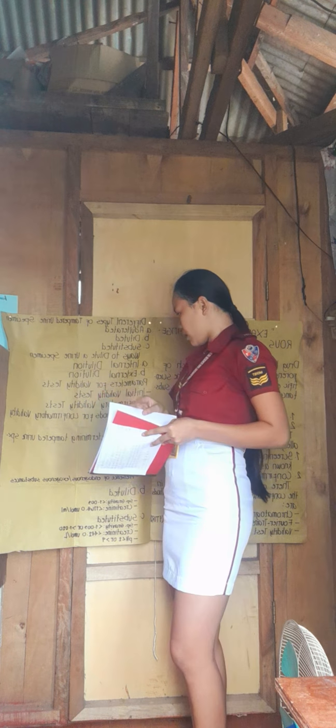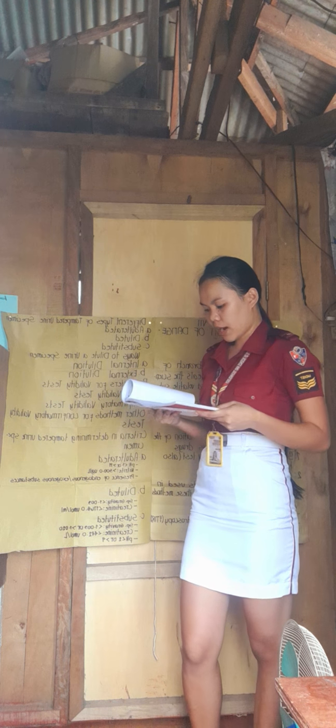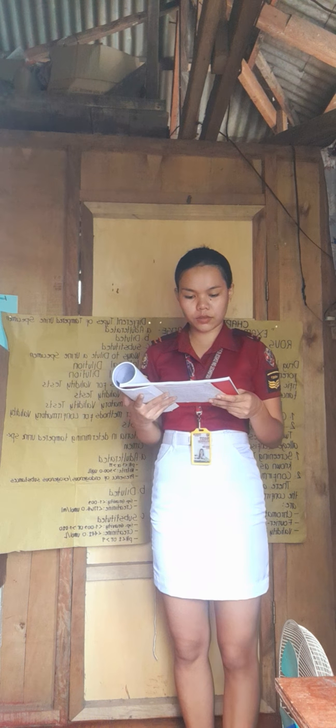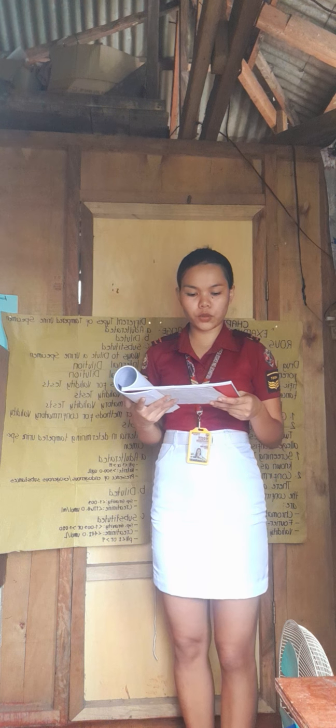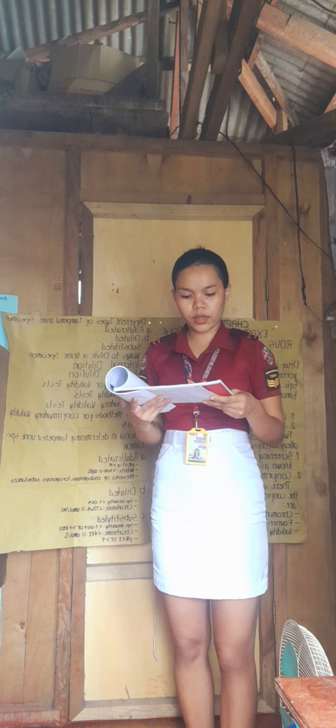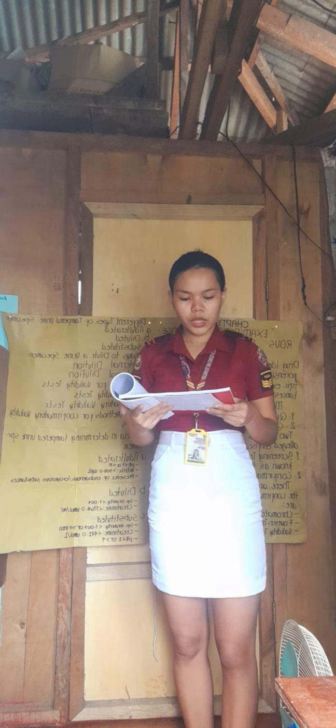So, other methods of confirmatory validity test. Physical characteristics visually determined. Volume same as physical characteristics. Temperature using thermometer, pH meters calibrated with appropriate buffers, specific gravity using a refractometer.